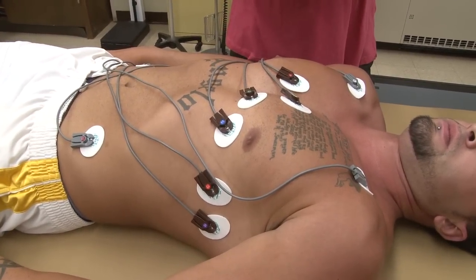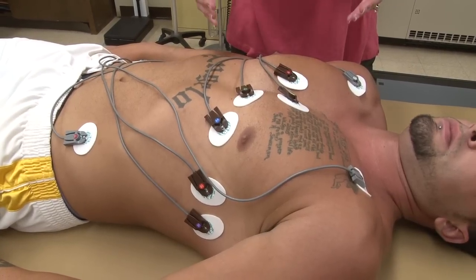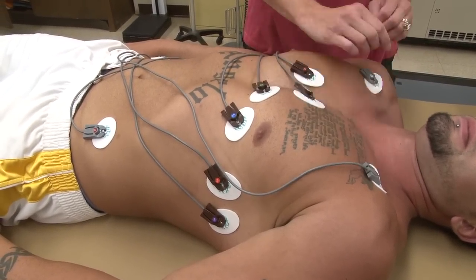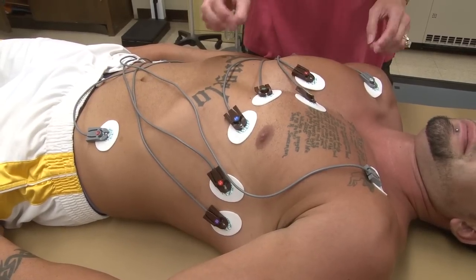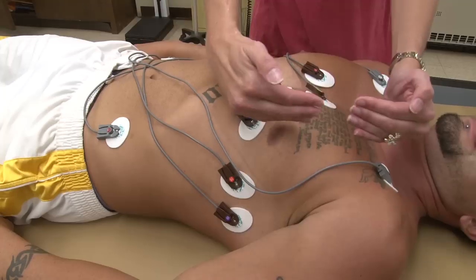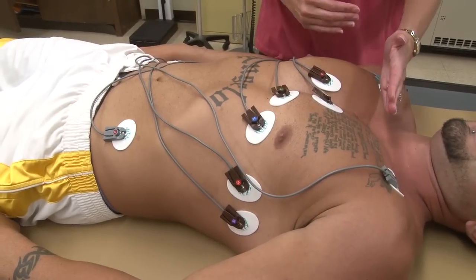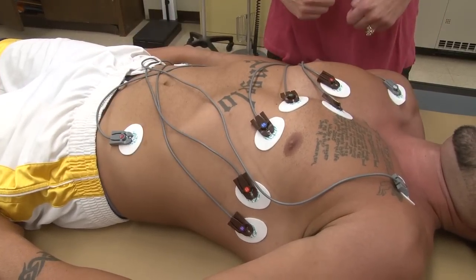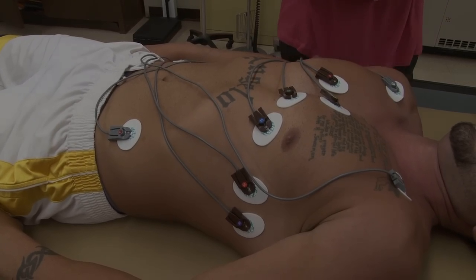Einthoven's triangle, though, also allows us 3 more leads to give us a total of 12. Those are lead 1, which is right arm and left arm, lead 2, which is the right arm to left leg, and lead 3, which is the left arm to left leg. So we're getting a view this way, we're getting a view this way, and we're getting a view this way of the heart. So we have a total of 12 different views.